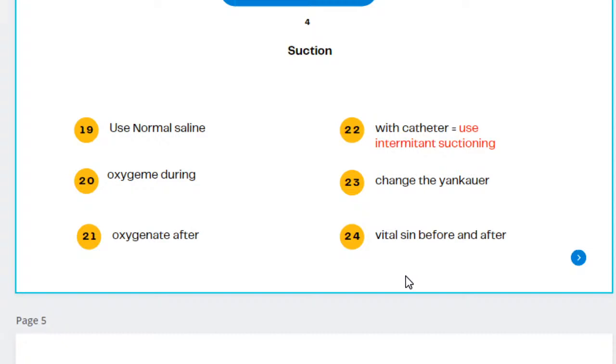So if you see the patient turn blue, you have to stop the suction and place the patient on oxygen. Very important. Babies can change on you in a second. Adults are easier than kids, but the kid might be very stable, and in a second you might have a code. So it's very, very important to oxygenate the patient, mostly kids.